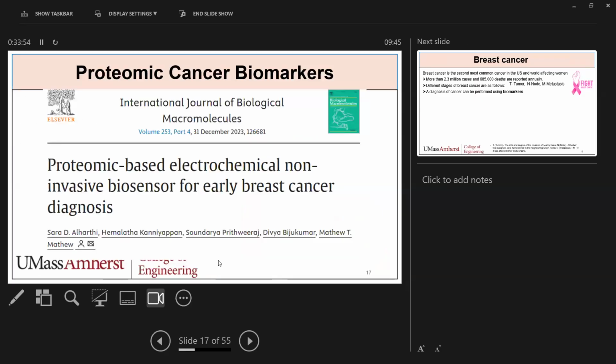So in today's talk, I'm not going to talk about all the cancers. I'm just going to give an example. I just explained one condition where we understood from scratch what exactly it is, what can be done, and how to overcome the conventional method's limitations.